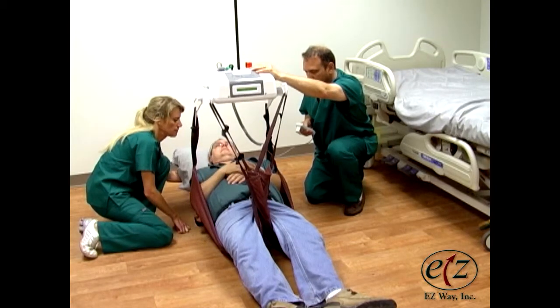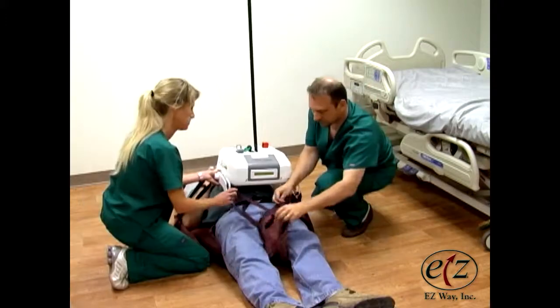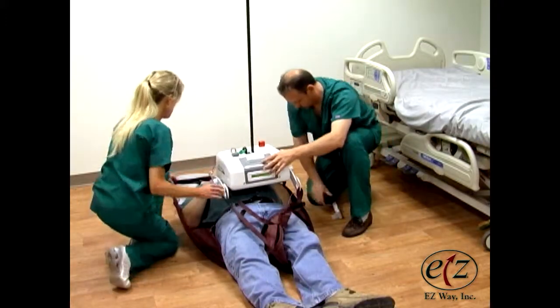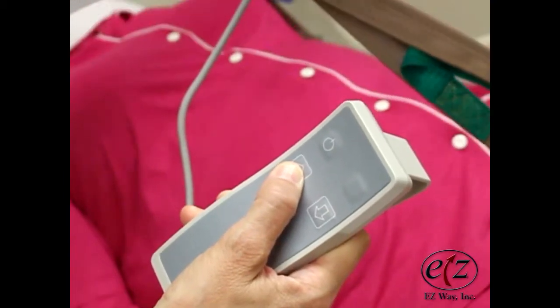Unless using a sling with head support, make sure to support the patient's head when lifting. Make sure all sling loops are securely hooked to the ceiling lift. Push the up button on the hand control to raise the ceiling lift.